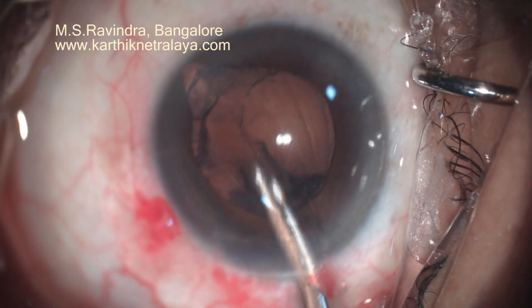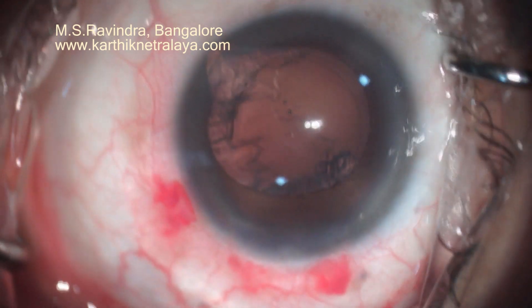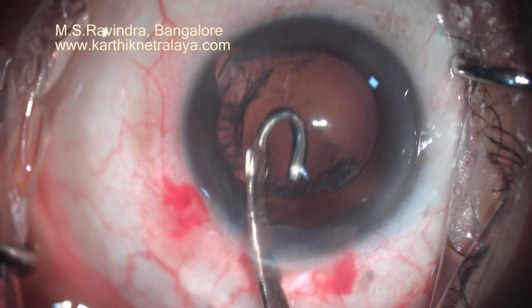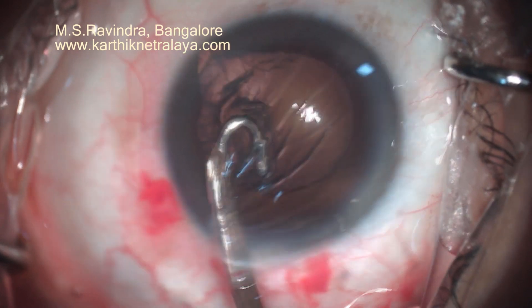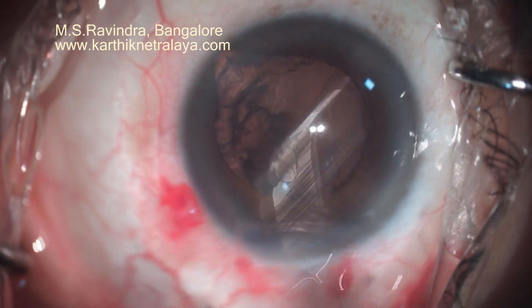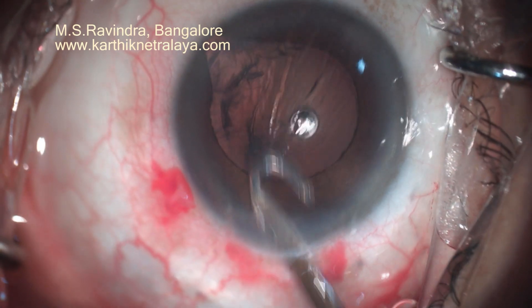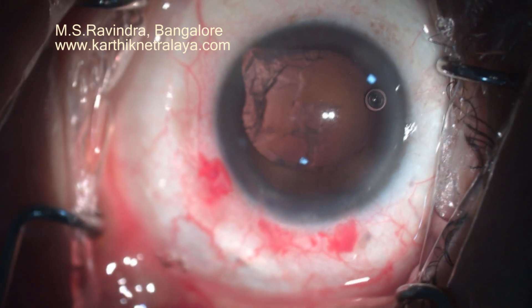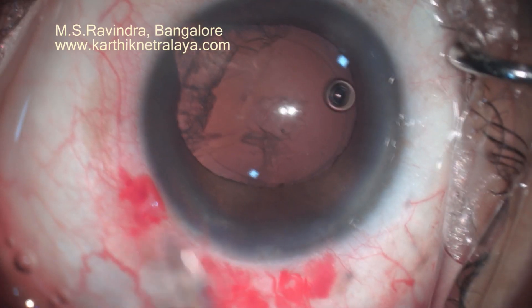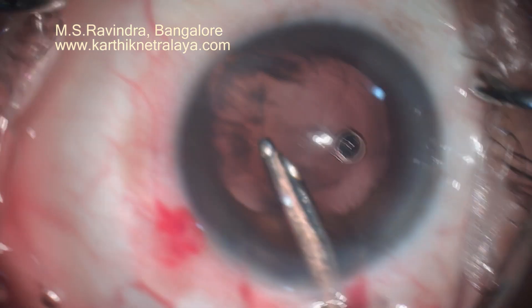The cortex at the coloboma area is handled at the end of cortical aspiration using a Simcoe cannula. The sub-incisional cortex can be aspirated with a J-shaped Simcoe cannula, which comes in a pair. This is a right-sided J-shaped cannula. The viscoelastic is replenished into the anterior chamber repeatedly.